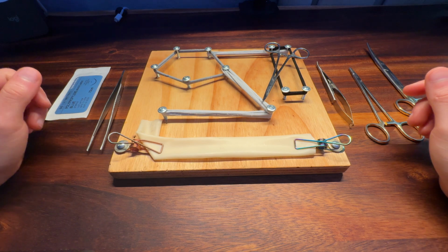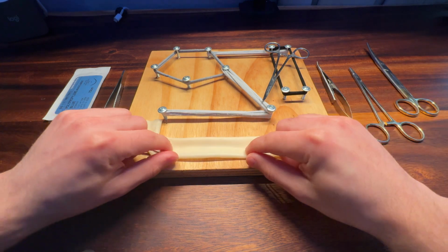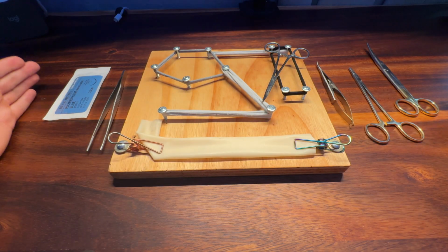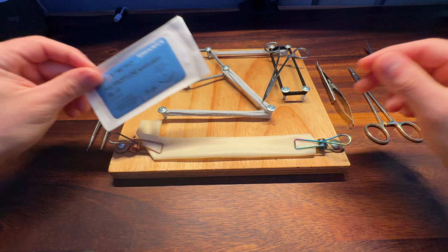Alright, welcome everyone. In this tutorial we're going to do a patch angioplasty. On the screen here I have pretty much everything you're going to need, starting off with the suture.